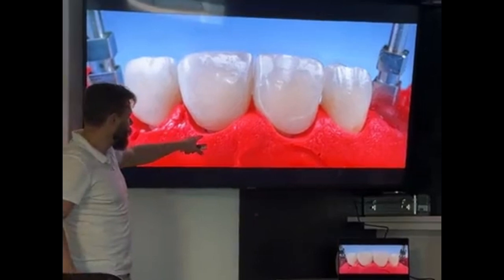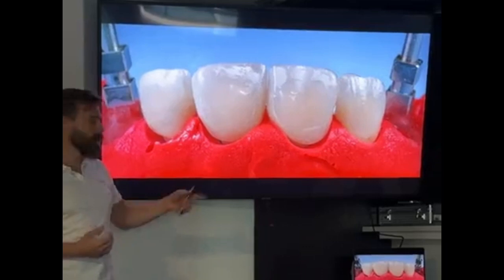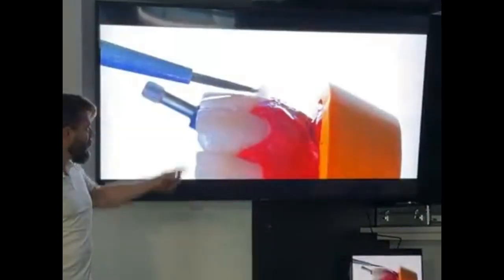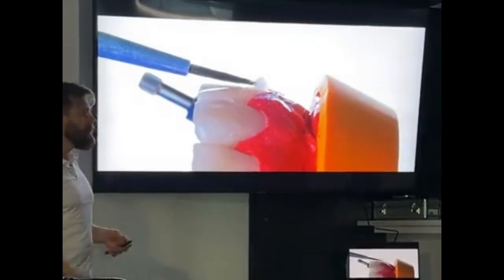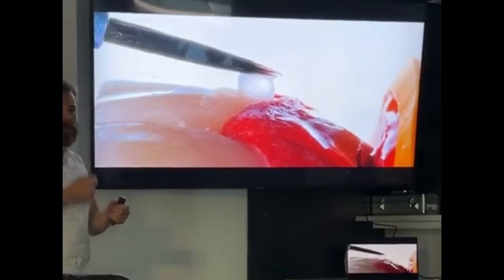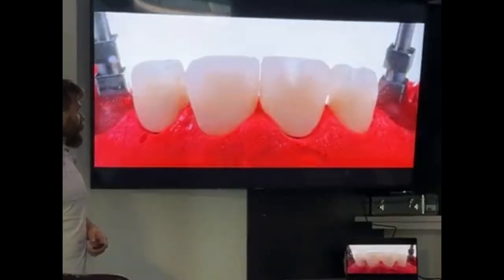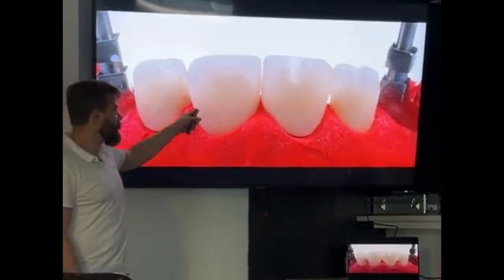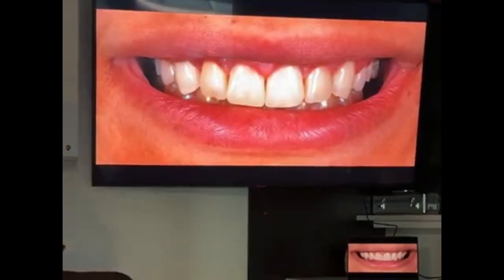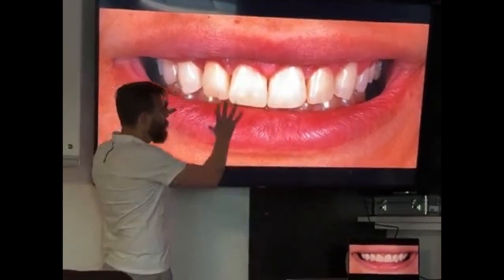Now, once again, what I need to do: drink a coffee, listen to some music, the patient is taking a nap, and you're going to have maybe half an hour, 40 minutes to modify this crown, adding in the gap here the acrylic necessary. Okay, so we're going to add the acrylic or the material that you like. If you like to work with flowable, according to the material base, sometimes one and another we have as option. What I need to do now: take the impression post out and one by one bring the crowns in. New shape, 1.5 millimeters, triangular shape, new proportion.